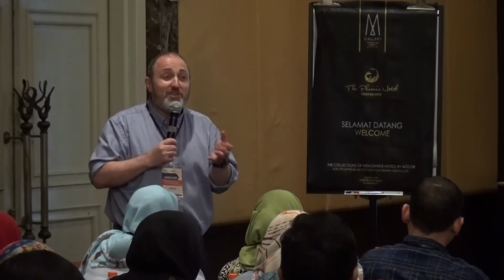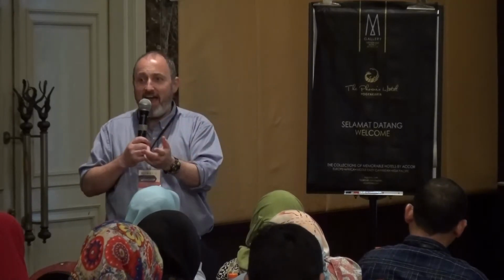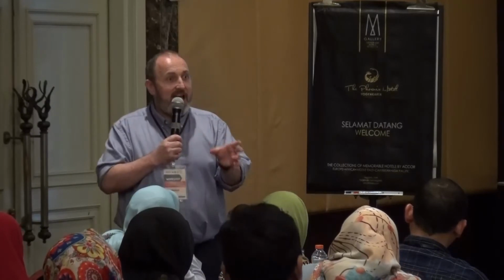In terms of classification, I'm encouraging you to consider in your units, we found it really helpful, to shift the thinking from it being a memory test to remember all the different criteria for reassuring, non-reassuring, and abnormal for baseline rate, baseline variability, and decelerations, and instead provide some tools to make it easy for people to remember those. Your job as a clinician is to interpret that then, and the tool helps you document it.